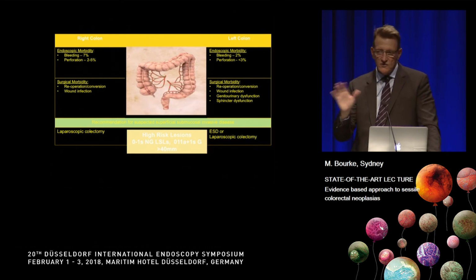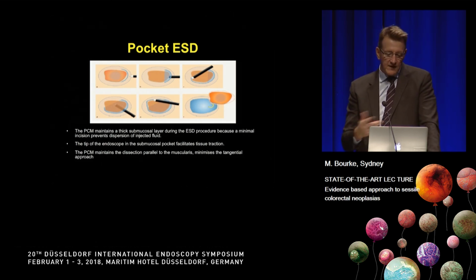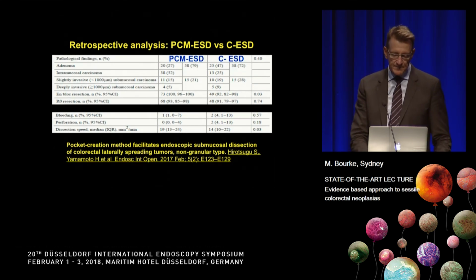Overall, most lesions do not contain cancer, and we can be confident they don't contain cancer. They can be effectively treated by EMR, and with these other techniques that I discussed, we can be free of recurrence going forward. There are other techniques coming that will make ESD easier. You've heard about pocket ESD. Unfortunately, it's a retrospective analysis by Yamamoto, the inventor, but it shows that it's faster.